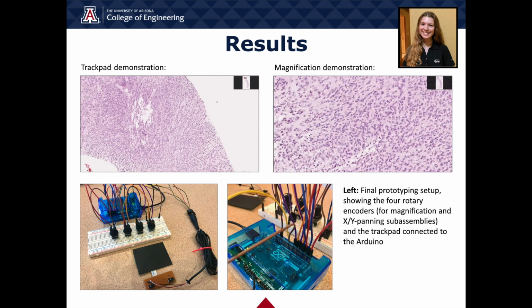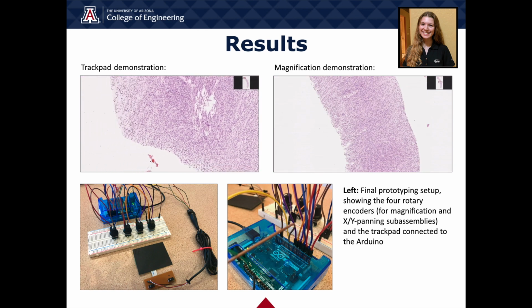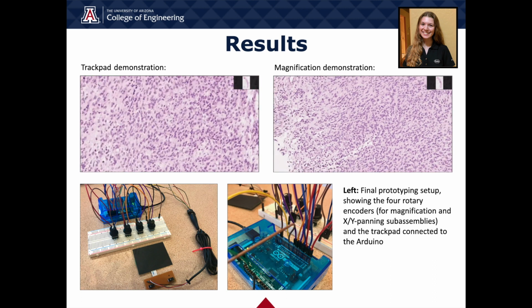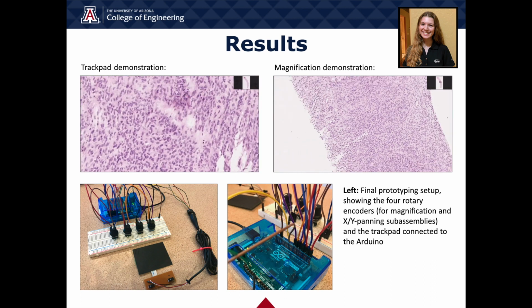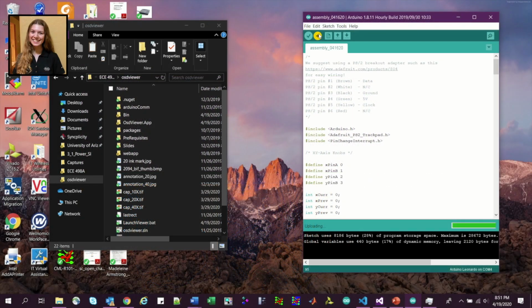The CPU of our system is an Arduino Leonardo, which, together with the panning and magnification subsystems, acts as a human interface device to control the digital image. The Arduino runs on a regulated 5-volt power supply through the micro USB that connects the system to a computer.